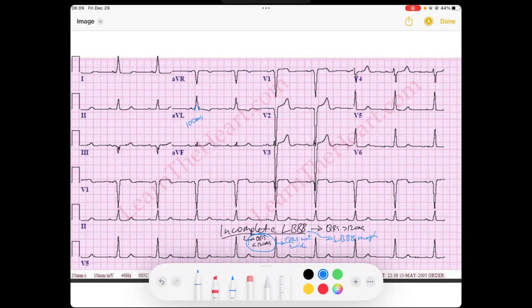Remember, for left bundle branch blocks — if you don't quite remember, go check out my left bundle branch block video where I go into the deep mechanism and why the morphology is the way it is. The key feature is that we get this RSR prime pattern in the lateral leads.